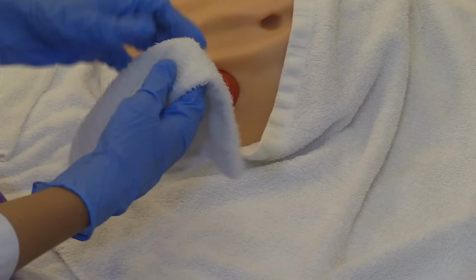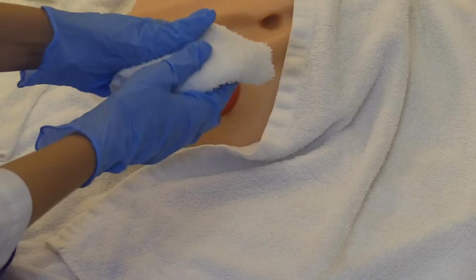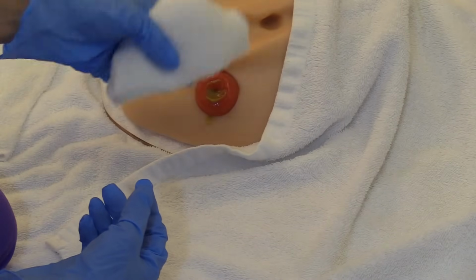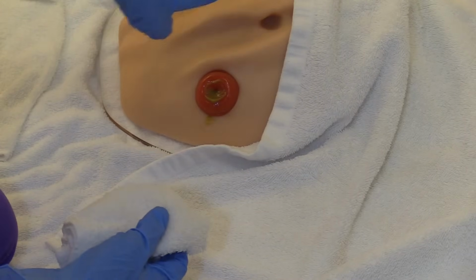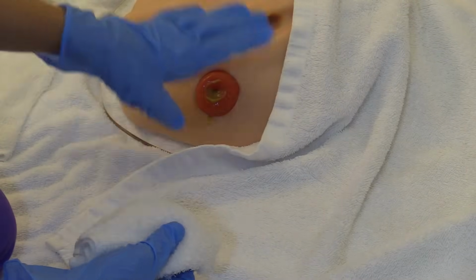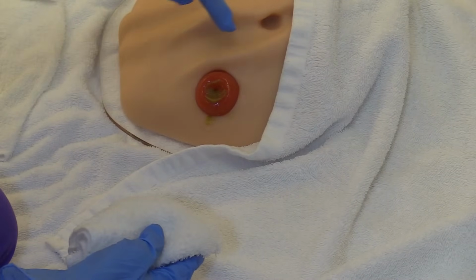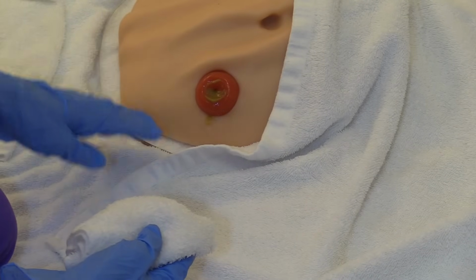Then you're going to take your washcloth with warm water. Try not to use any soaps that have lotions, powders, creams, or any alcohol-containing products around the stoma or on the stoma because it causes some problems.